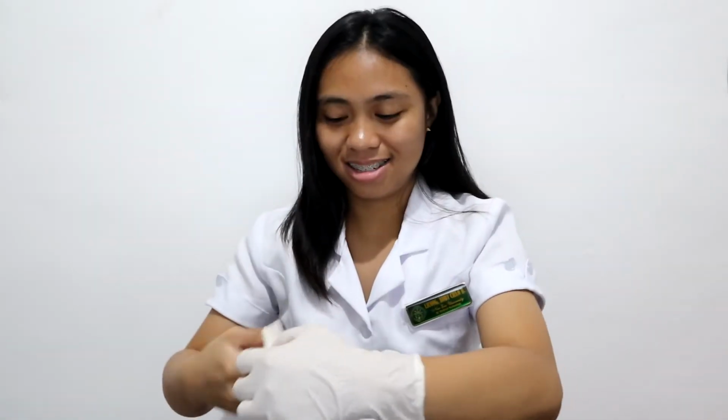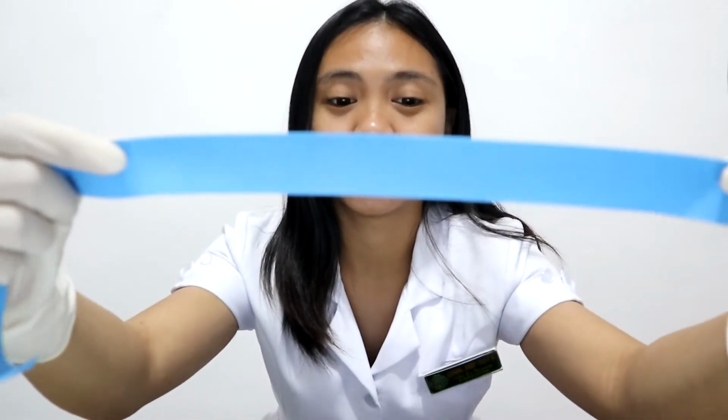Both hands. Next is the application of our tourniquet.